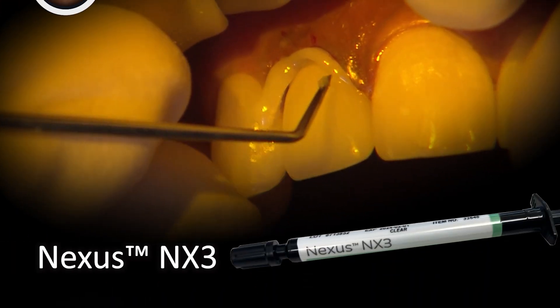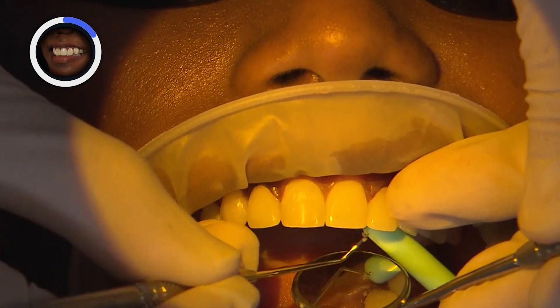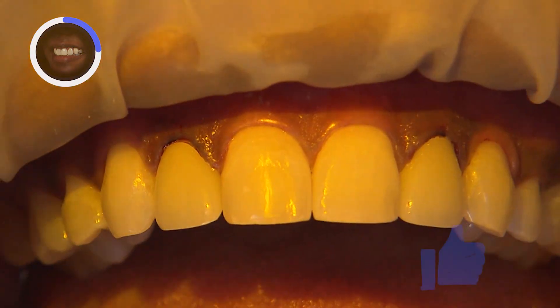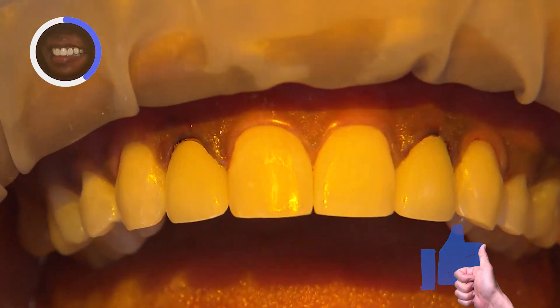The restorations are loaded with clear Kerr NX3 adhesive resin cement and then seated into place. With a tack cure of about three seconds on the facial and lingual, the excess cement enters a gel state for easy removal.